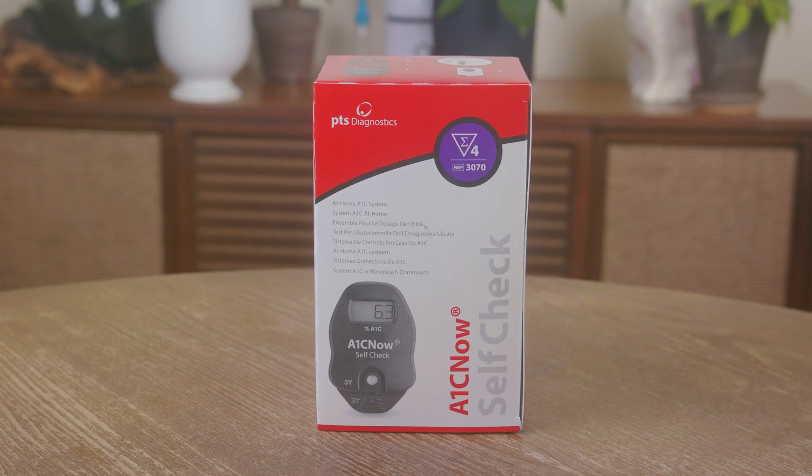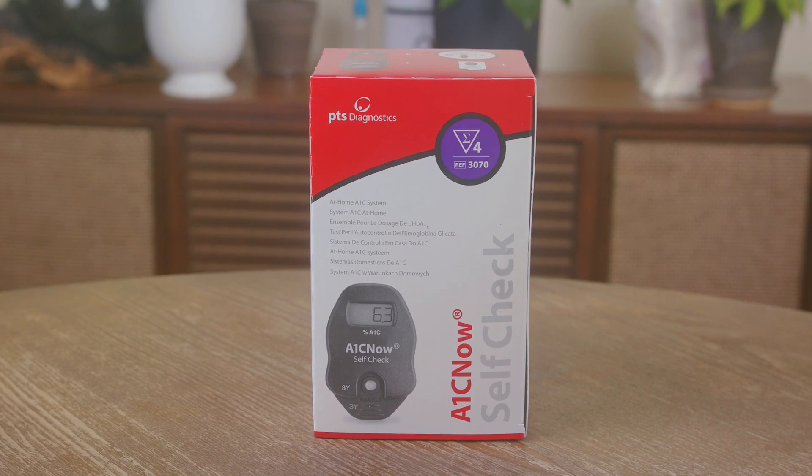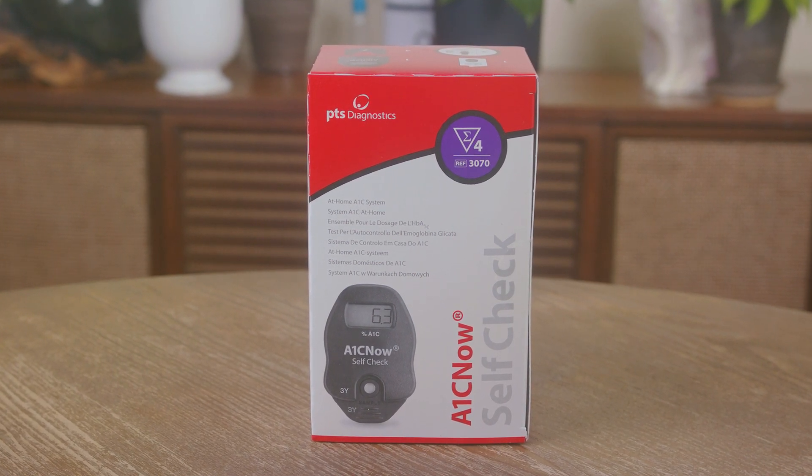You may also need a band-aid — pause the video now if you need to get one before you get started. This box comes with four tests. It's important that you only use one shaker pouch and one cartridge pouch per test. Leave the remaining pouches in the box and store at 64 to 77 degrees Fahrenheit.